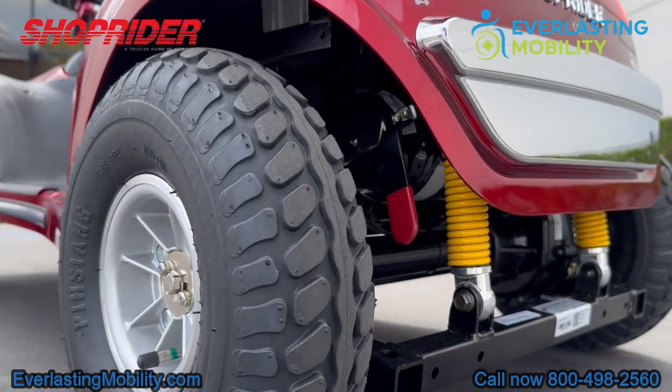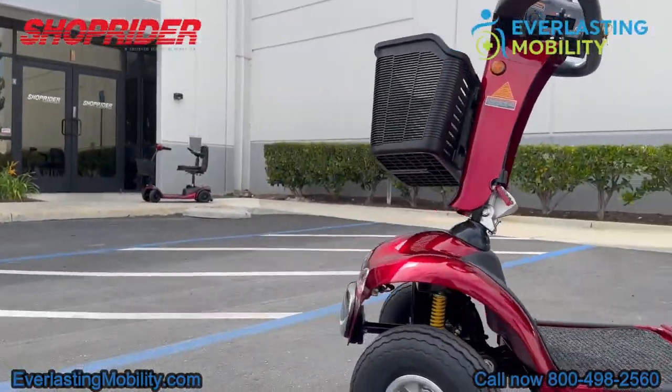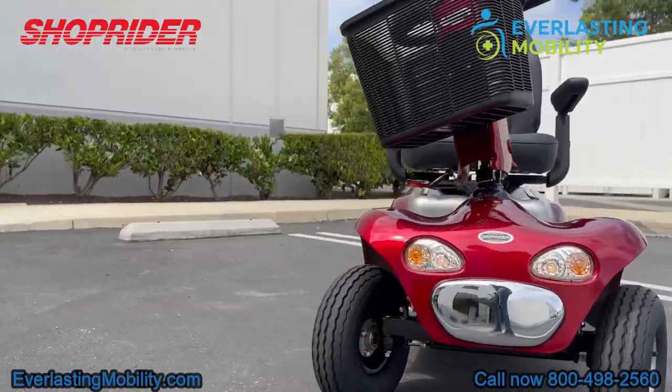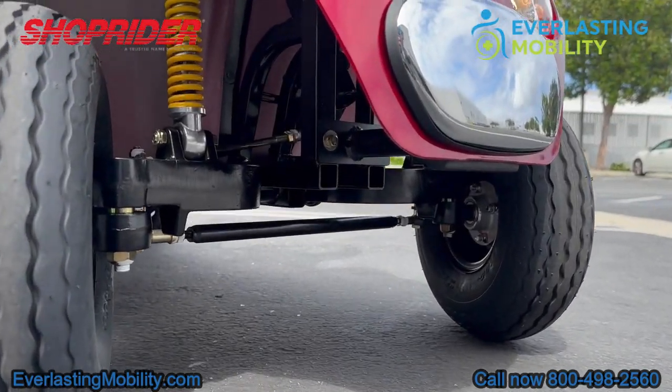On the back of the scooter there are two springs that support the user with a rear suspension. In addition to that, there is a front suspension on the scooter as well. There are two springs on the front, giving you a lot of support when going over rougher terrain.